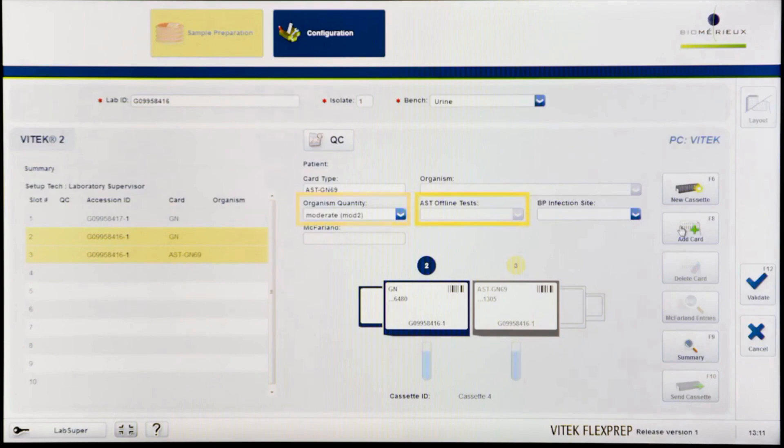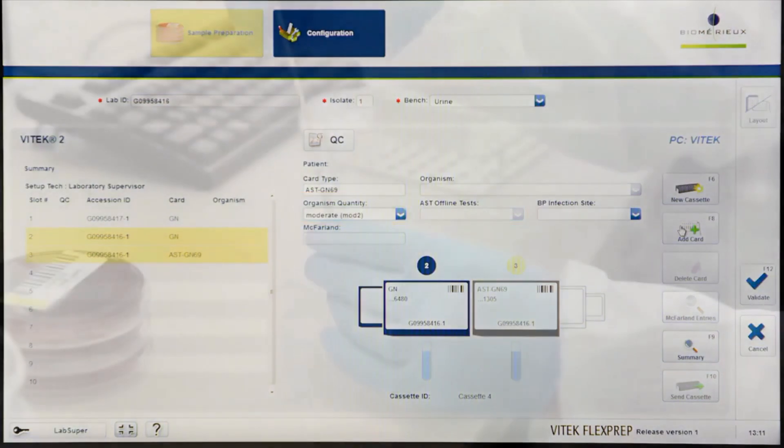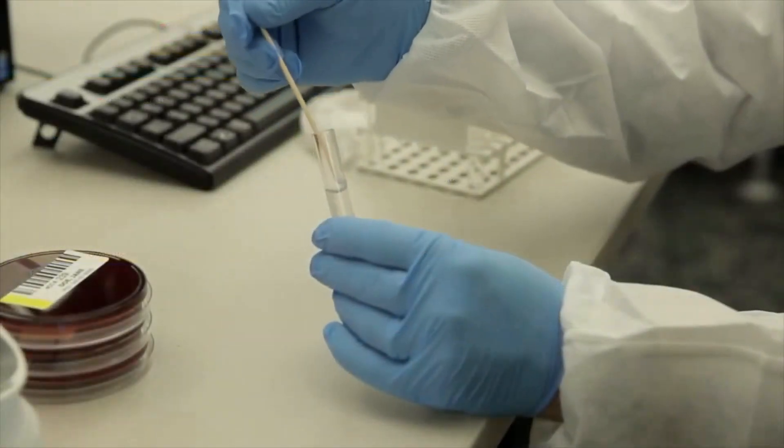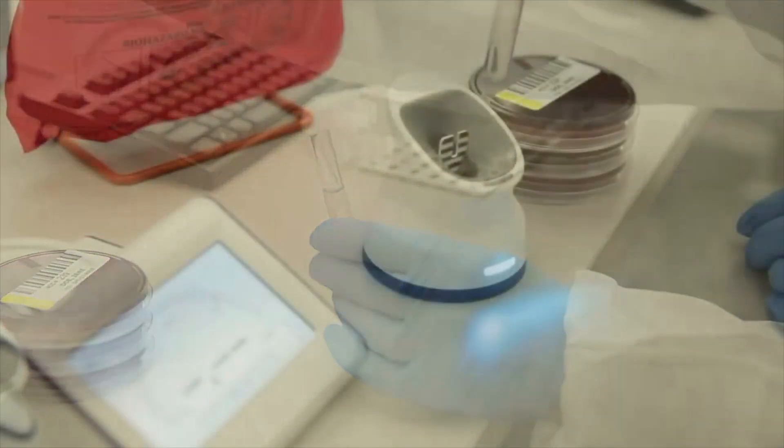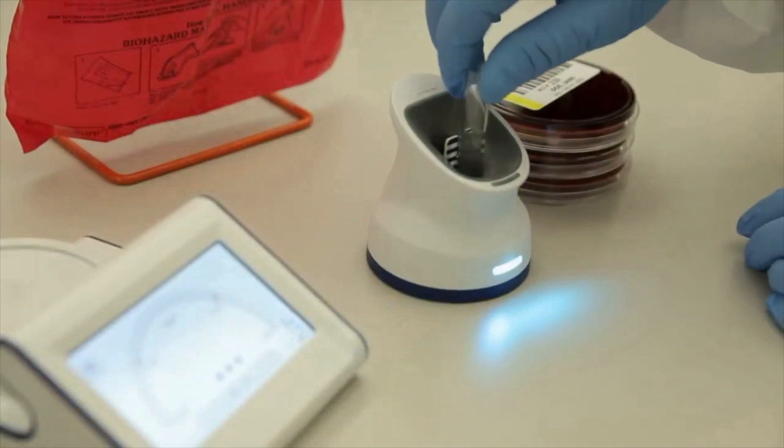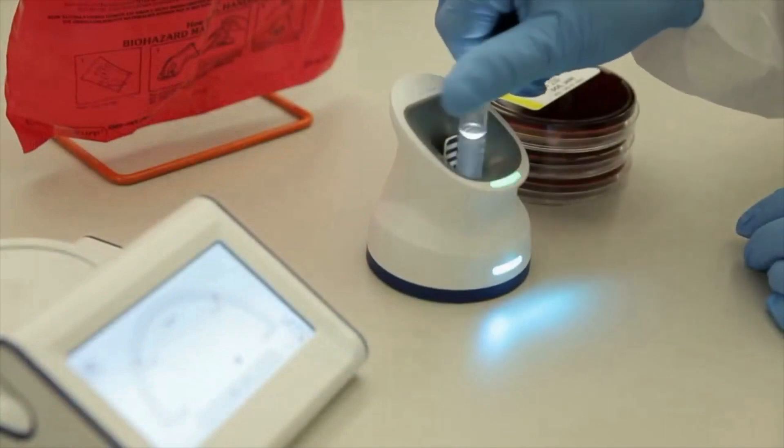In this video, the Vitek DensaCheck will be used to record McFarland values. Prepare the organism suspension using well-isolated colonies of an appropriate age from an appropriate media.